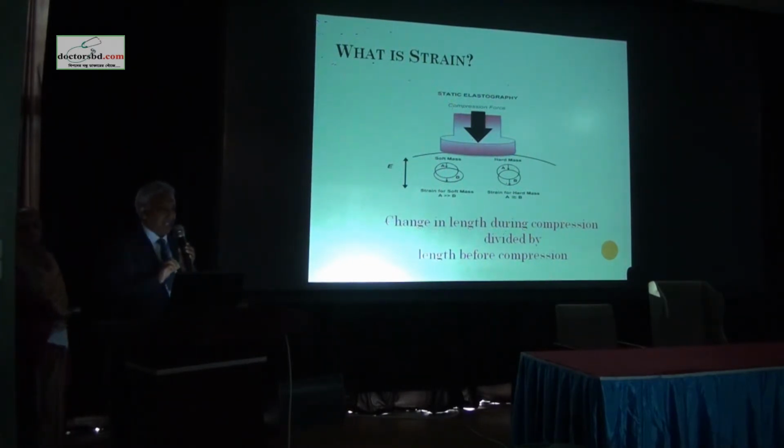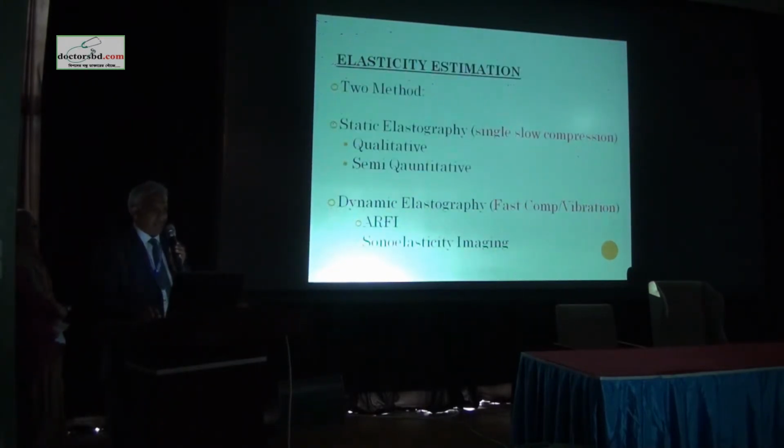When you apply pressure, the softer tissue will show deformation in axial as well as lateral directions. Lateral deformation is much more than the axial deformation, while in harder tissues you will not see any lateral deformation, only axial deformation. Meaning thereby, the pressure and the change are almost equivalent. That means there is no strain; the tissue has lost strain. That is what happens in response to elastography in harder tissues.